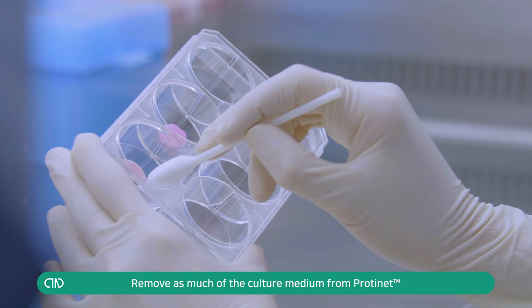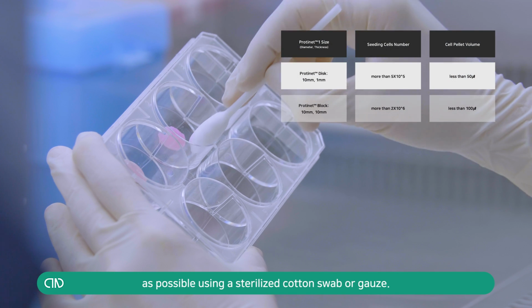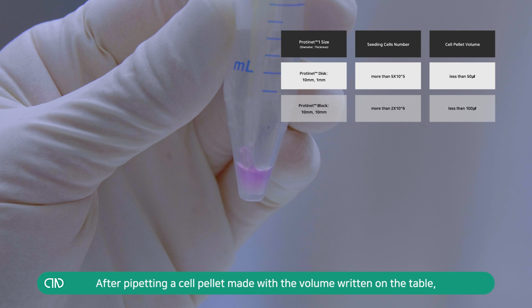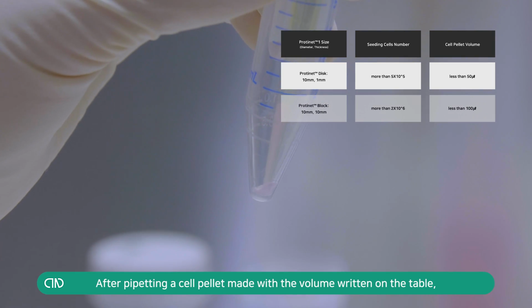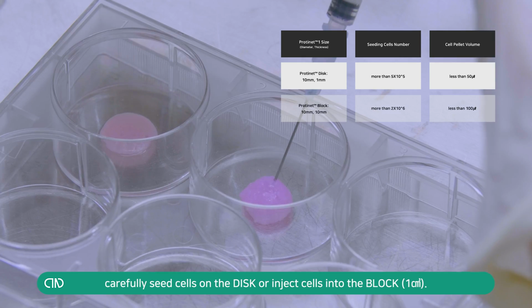Remove as much of the culture medium from Protinet as possible using a sterilized cotton swab or gauze. After pipetting a cell pellet made with the volume written on the table, carefully seed cells on the disc or inject cells into the block.